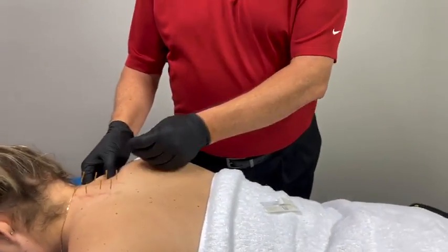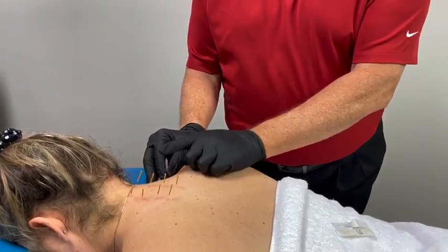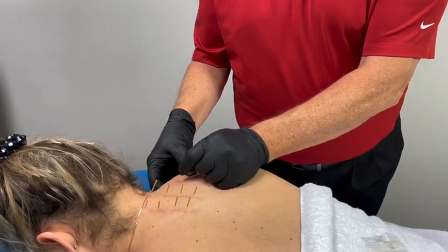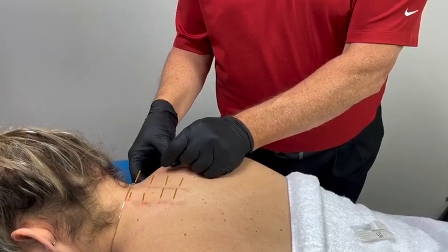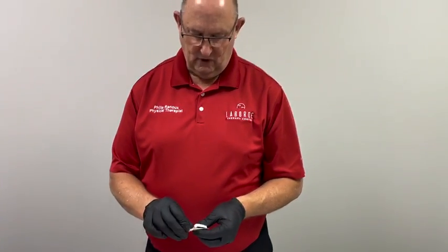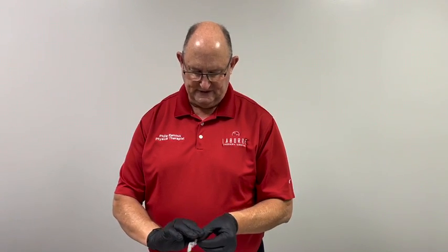So by doing that, I find where I want to stick it. There's a little piece of glue holding it in. I tap it and the needle's in, and then what you do is you stick it through into the muscle and you turn it slightly to grab the myofascial tissue. And the reason you do that is the dry needle will go in there and grab the myofascial tissue, kind of like a fork sticking in spaghetti, and you just twirl it to eat it.